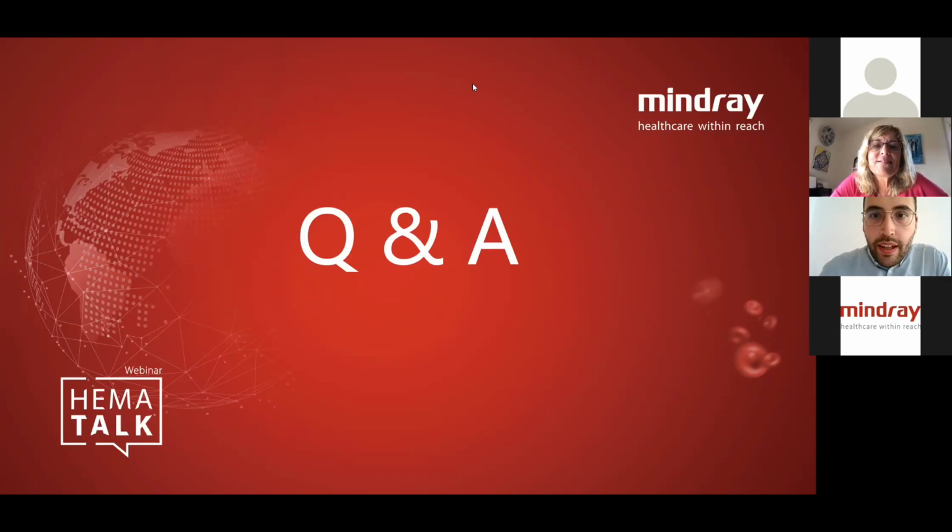Okay, Ramon Simon says, do you think that low NEX, NE side scatter dispersion may help to improve the detection of myelodysplastic syndromes? Maybe yes, because the neutrophils in the myelodysplastic syndromes are not normal.